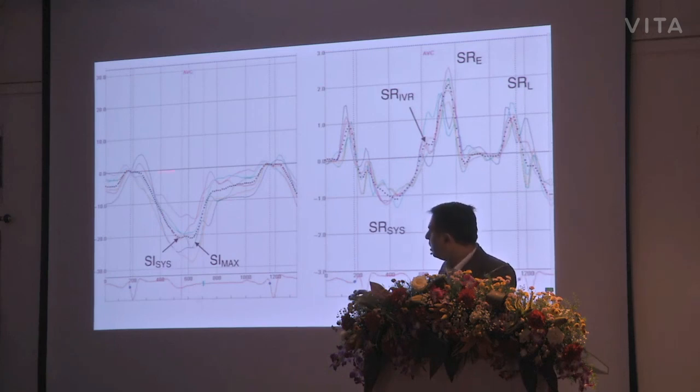We maximally use in clinical practice the strain curve. We use the strain curve because it's easy. Once we know where the aortic valve closes, we know whether it is systolic strain or if the strain is post-systolic, and which is the maximal strain.